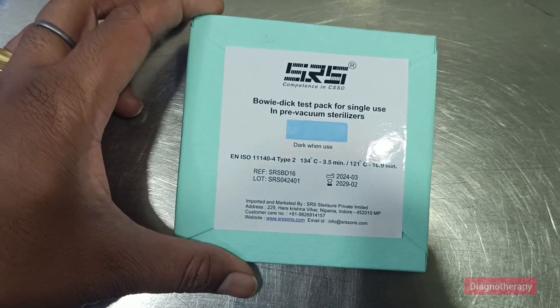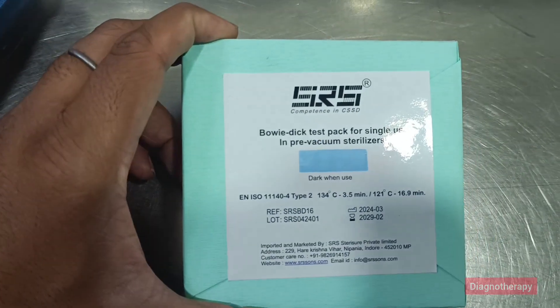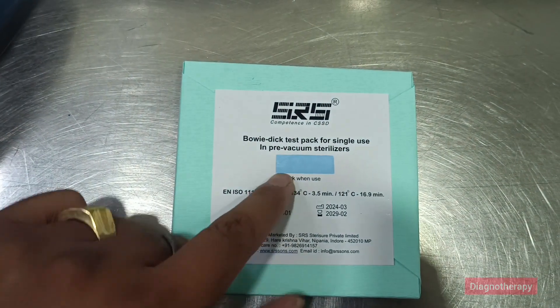The test evaluates the performance of the autoclave, particularly the effectiveness of the initial vacuum phase and the temperature and pressure of the steam during sterilization.